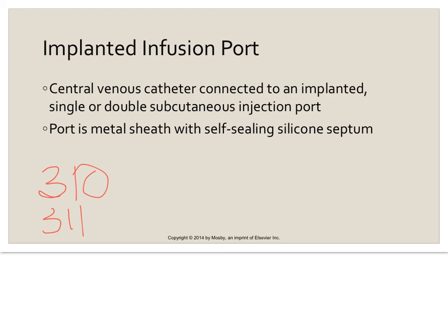So infusion ports typically are used for people who have some type of chronic need. Maybe they have, for instance, aplastic anemia and they need chronic red blood cell transfusions, or maybe they're on chemotherapy.